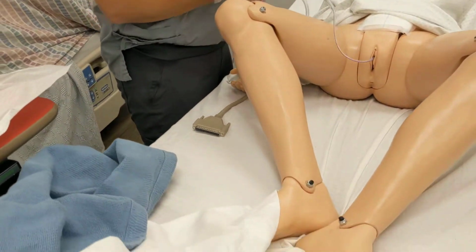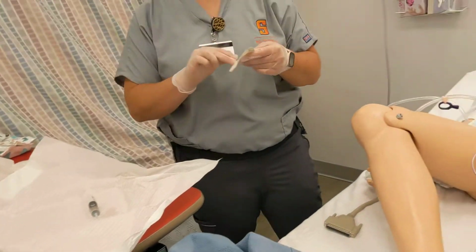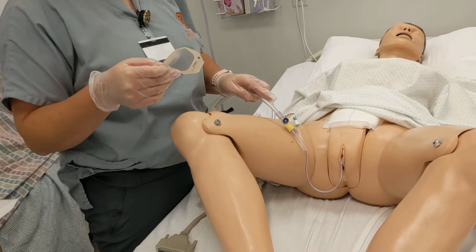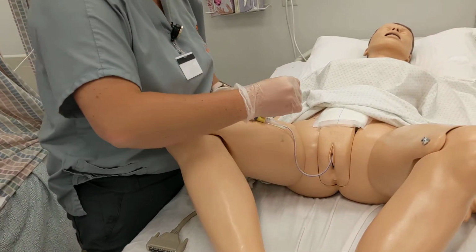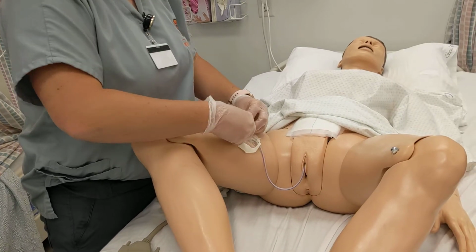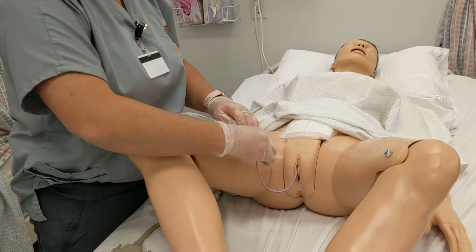All right, and now I am going to attach this to the patient. It's going to go right here. And we just want to make sure we give them enough room to move so it never tugs.